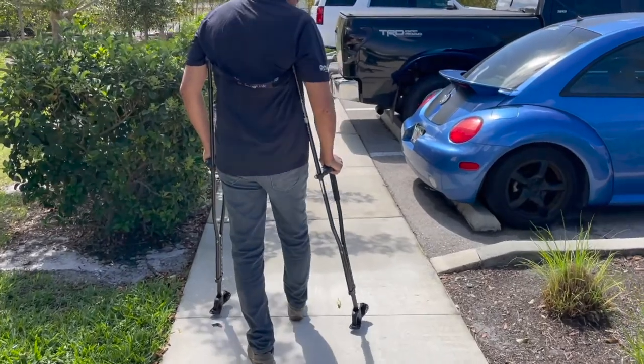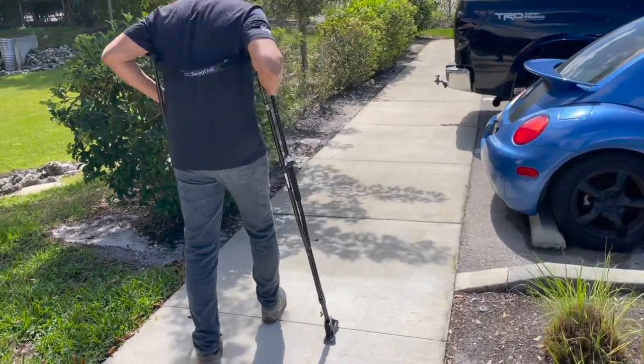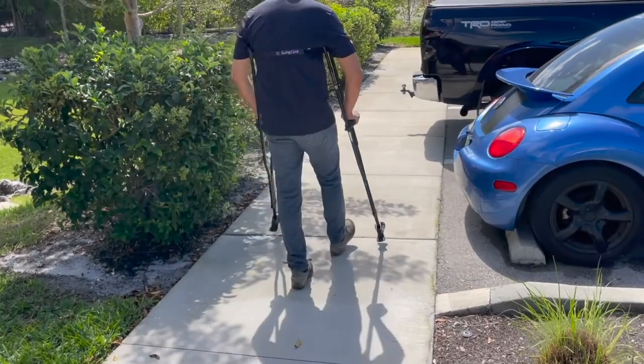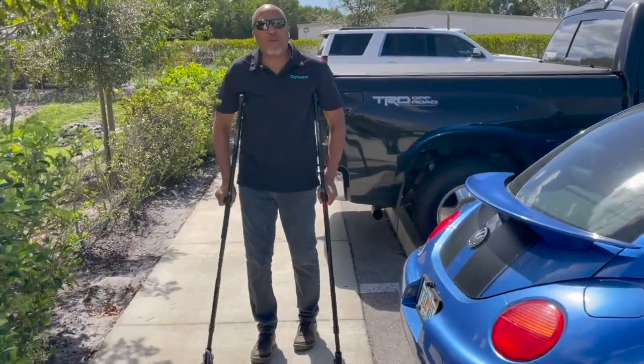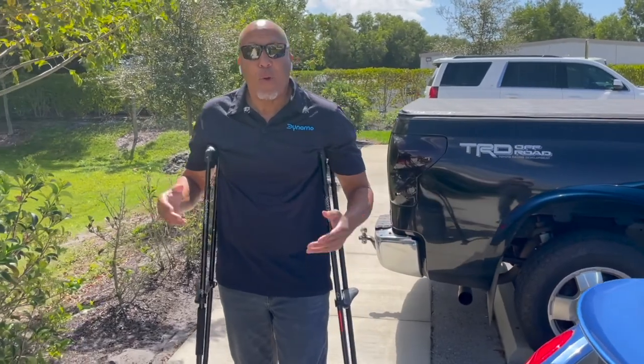If I go a little off balance — boom, look at this. It's not going anywhere. I'm very stable. But this is not a good test — we designed the Swings so you can live your life. Our motto is walk, run, play. So we're going to take you on our course and test everything.